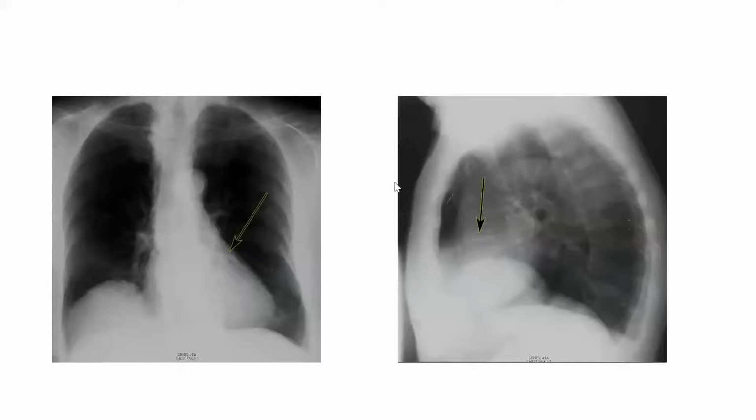Sorry, Abbas, we missed the sound. You missed the sound? Okay, good. Anytime, please, you miss the sound, let me know, okay? So I'm asking, what are these arrows pointing to? Take a guess. Take a guess. Did you hear me? Yes. Okay.